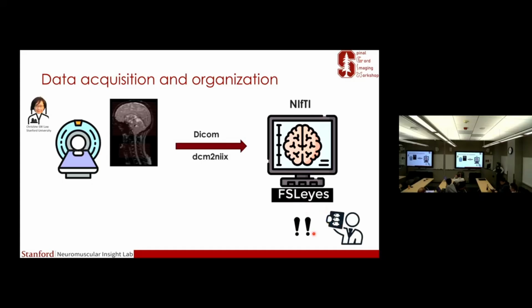So yeah, it's very important to look at your data. And then how do we name our data? That's actually a very important question, especially if you want to share it with someone else. I can name my data however I want, right? I can name my data version 2, my data version 3. But obviously that would be very terrible for reproducibility purposes. Also, if I give you the data, you would have to ask me so many questions.